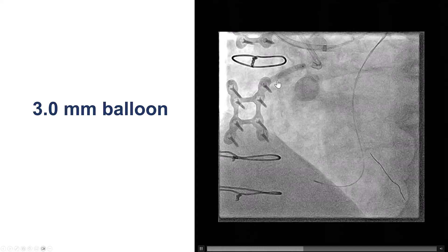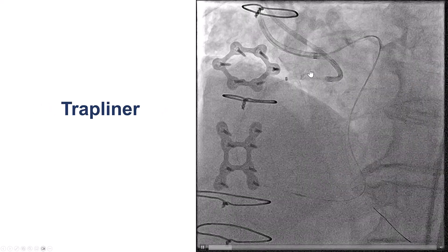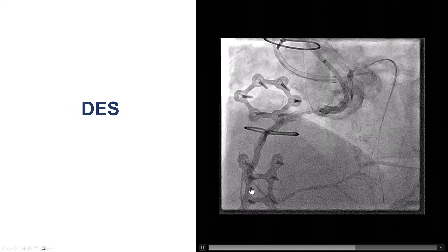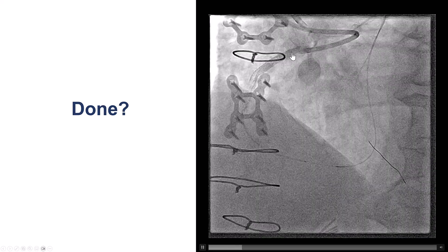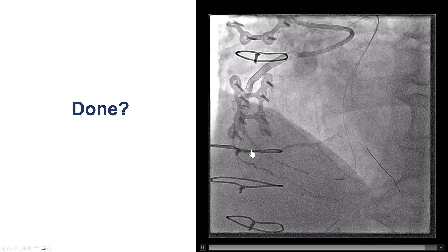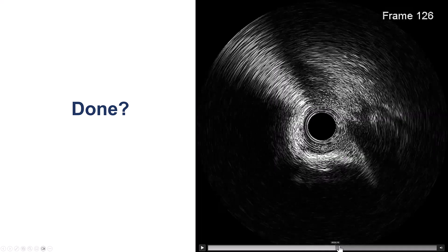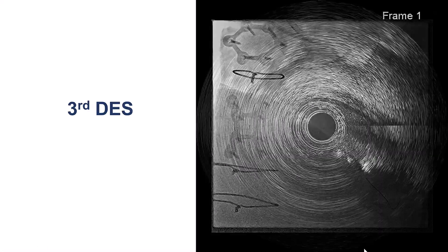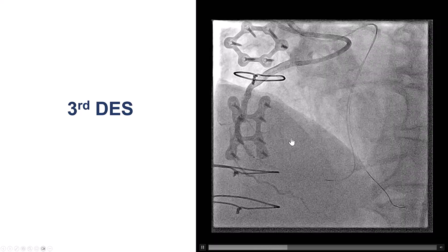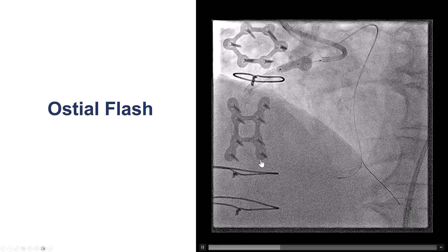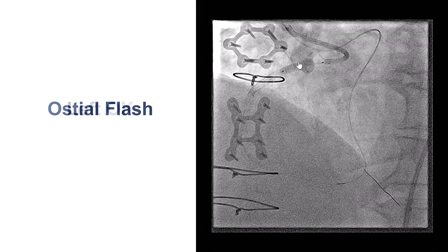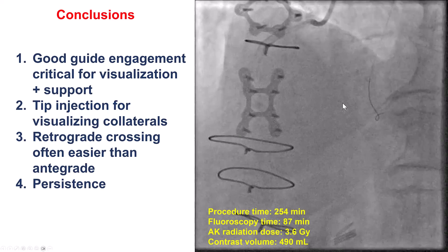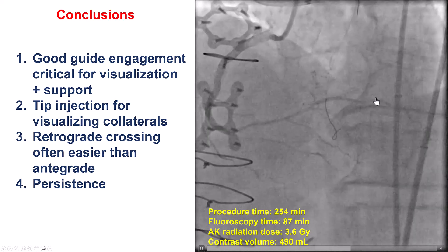We predilated with 2.0 and 3.0 mm balloons and had some nice expansion. We did an injection which appeared to be causing dissection, so we stopped injecting. We then placed two stents from the mid-RCA all the way to the ostium. Afterwards, we had good antegrade flow, but there was still a size mismatch distally. On intravascular ultrasound, we may have had a distal edge dissection. We placed another drug-eluting stent all the way to the PDA/posterolateral bifurcation, and after doing that we did an ostial flush balloon to facilitate re-engagement in the future. We removed the externalized wire and confirmed no injury to the left system, achieving a nice final result with TIMI 3 flow into the right coronary artery.